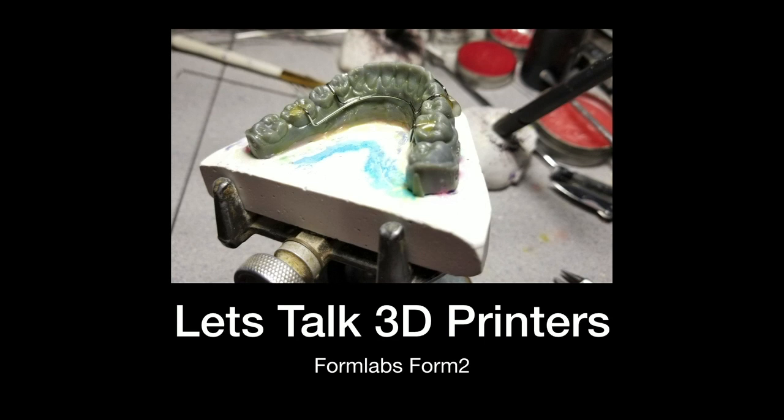And I noticed when I was sprinkling the 3D printed models, I made the base so small my hand would cramp trying to hold it and sprinkle. So this big base is better for my big hands.